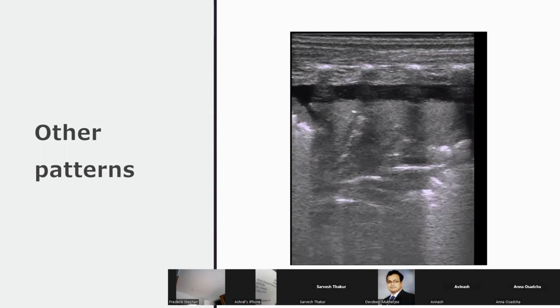Here, looking at that effusion, if that's what I see in the posterior space, I wouldn't. That's not a very large effusion. When I measure it, it comes out to be a centimeter. The bigger risk is if I try to tap that, I might actually puncture the lung.